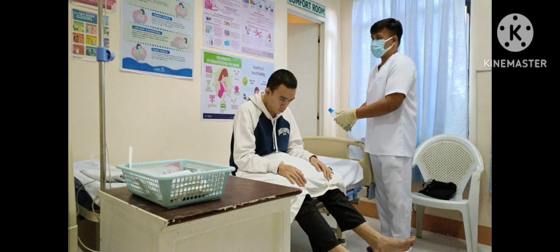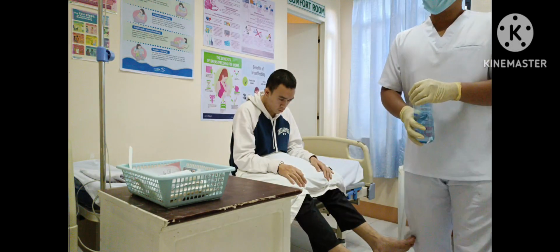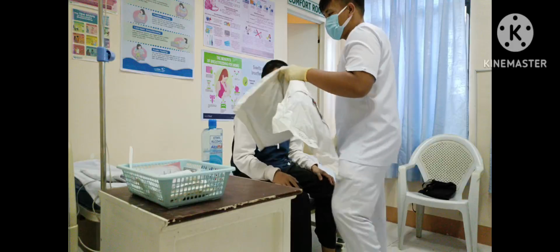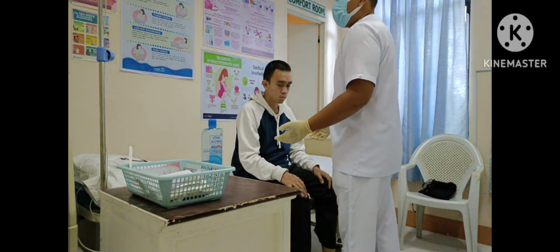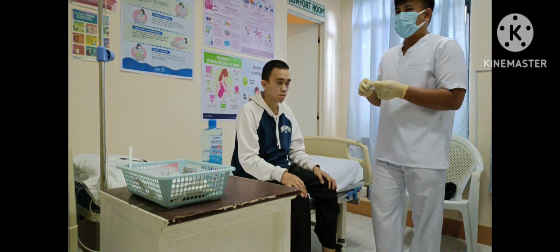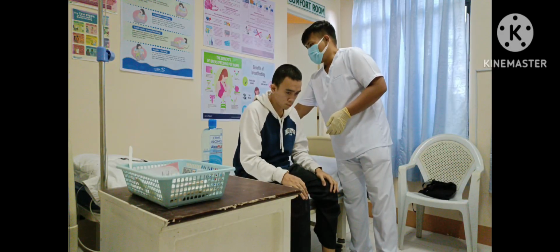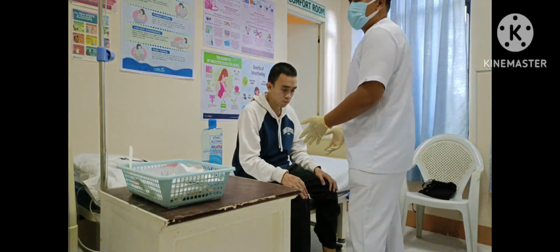Assuming that the doctor has collected the necessary sample, I'm just going to close this and put this here, and then I'm just going to remove this pillow from the patient. Now I'm just going to position the patient, and I'm going to put pressure on the injection site to avoid bleeding. After that, I'm going to position the patient in a prone position, sir.